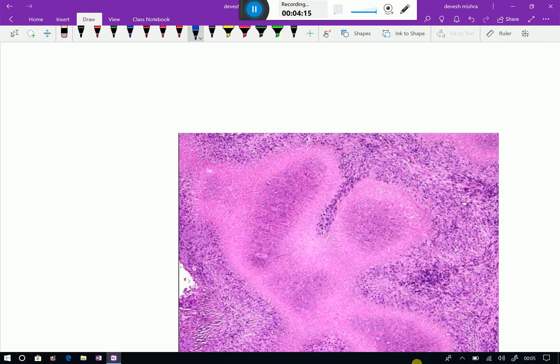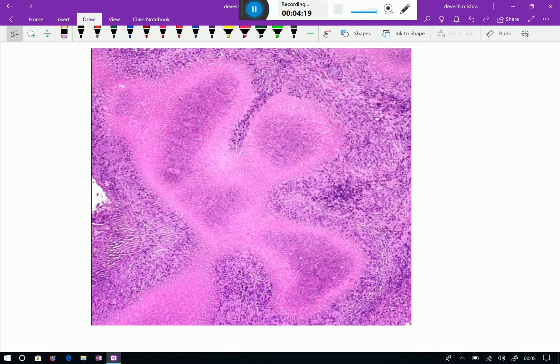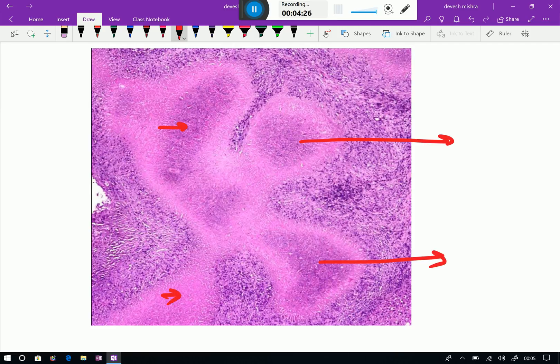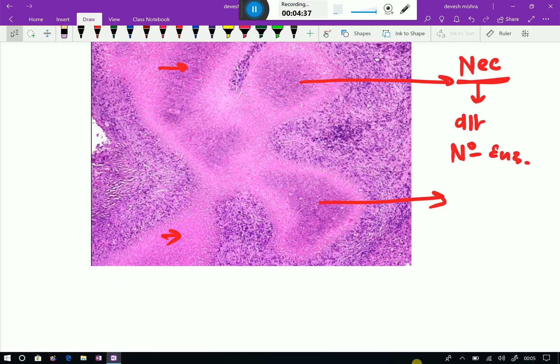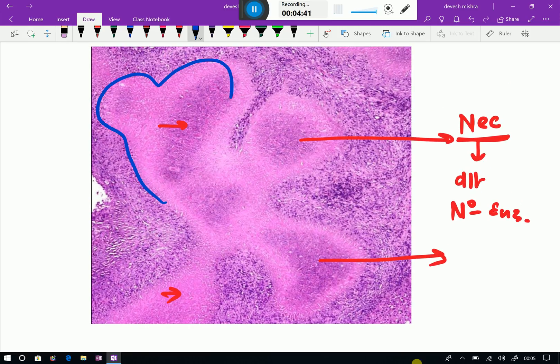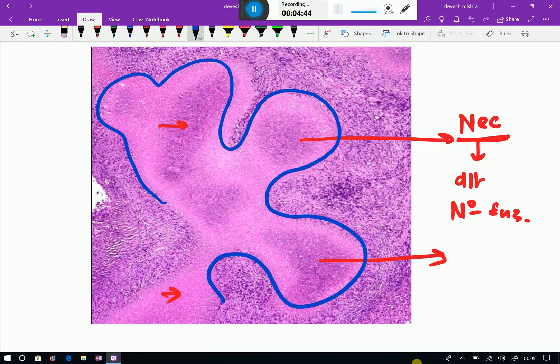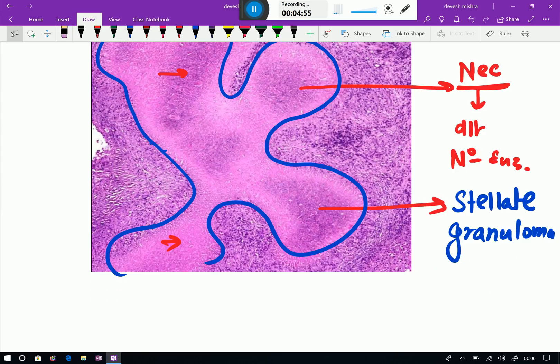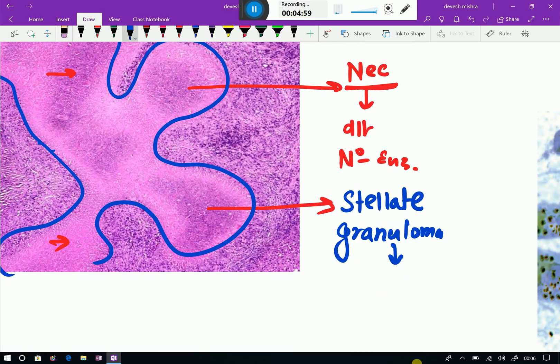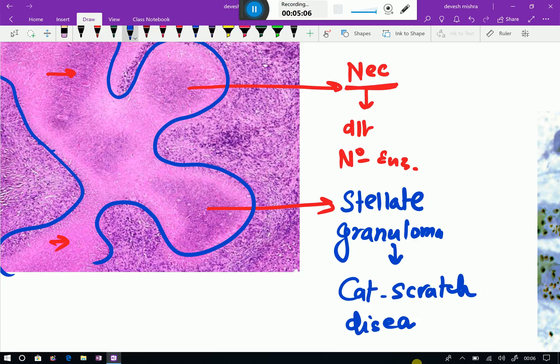Now you can see one more granuloma — a different kind where all these eosinophilic areas I am marking are necrotic areas, because of neutrophilic enzymes. Because of this necrosis, if you observe the pattern of necrosis, you will observe that it is like a star shape. That is why it is also called a stellate granuloma. Stellate granulomas are seen in cat scratch disease.